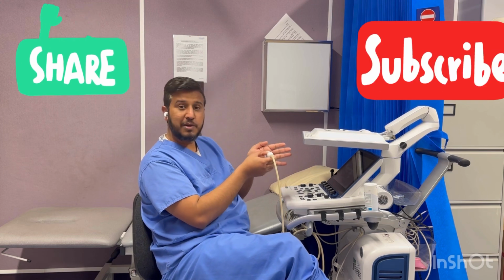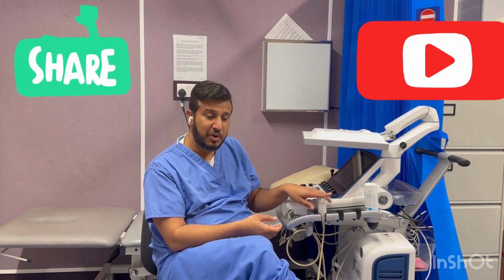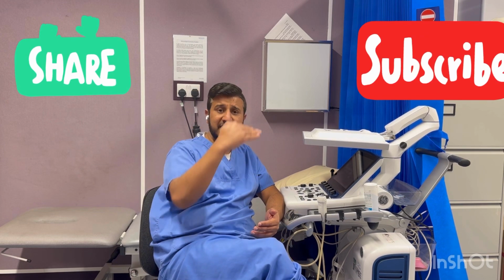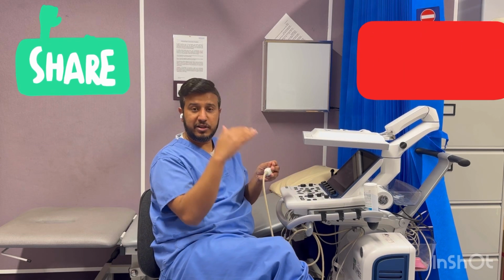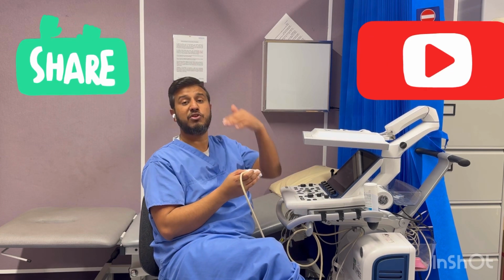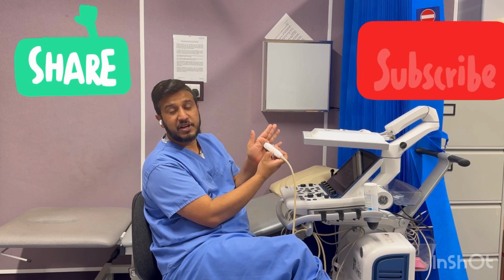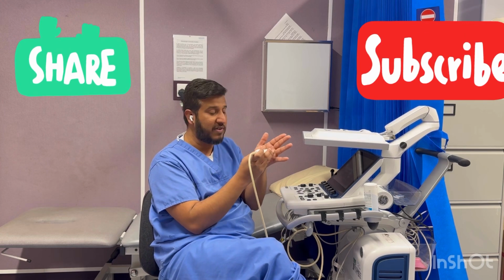So this one, you will keep your probe this way to get the short axis views. In short axis, you will get different views. There are different areas, step by step. First, you will keep your tail down like this to get the image, which is your pulmonary valve. First of all, you will get the pulmonary valve, okay?